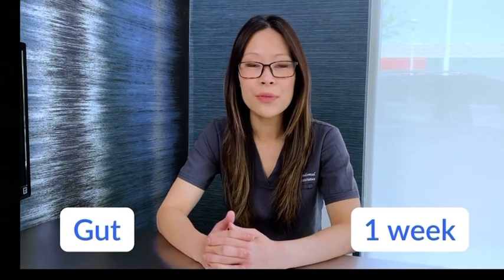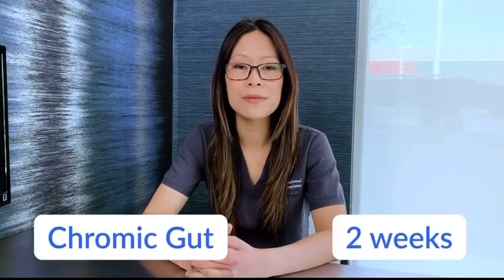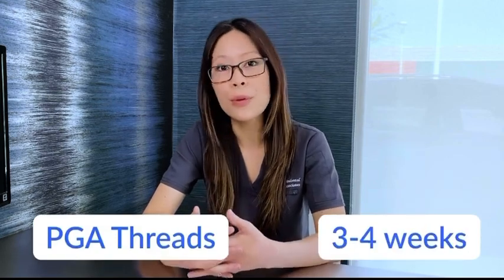The absorbable time is the largest factor to consider in the decision-making process. Plain gut typically takes about a week to absorb, and it is very useful for extraction sockets or simple flap closure. If you need the gut to last an additional week or 2 weeks in total, you can choose chromic gut sutures. PGA threads will absorb in about 3 to 4 weeks.